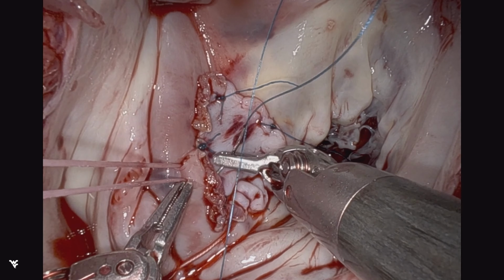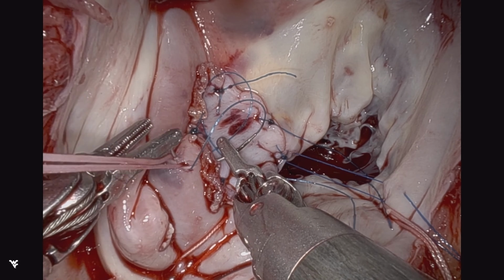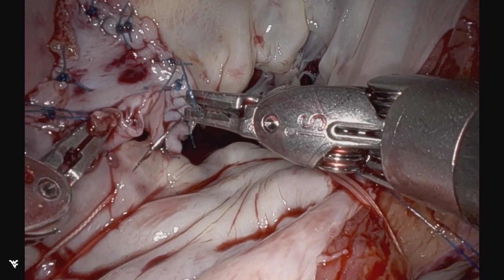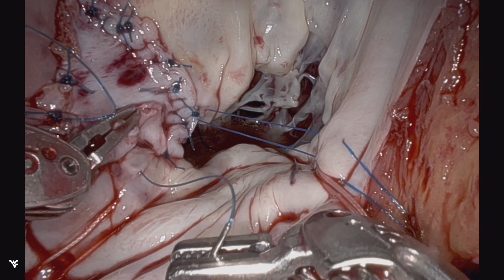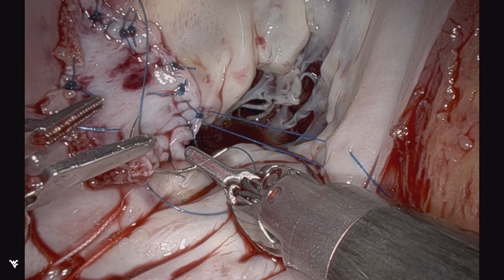Using a running technique, again, the same monofilament suture. And then to complete the onlay patch, this is more of a reconstruction now of P1. And once that's complete, we'll do the completed anastomosis to the residual tissue of the posterior leaflet.